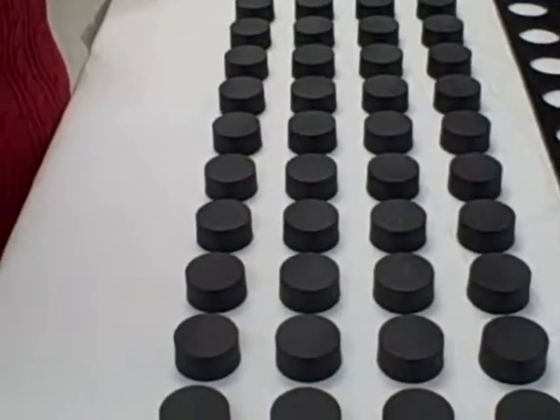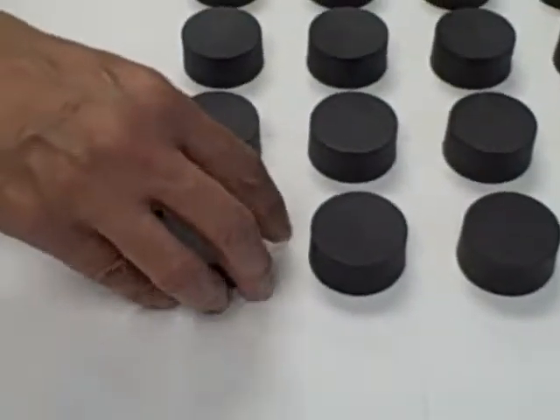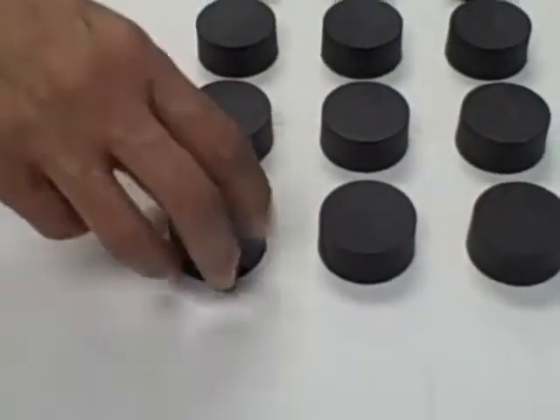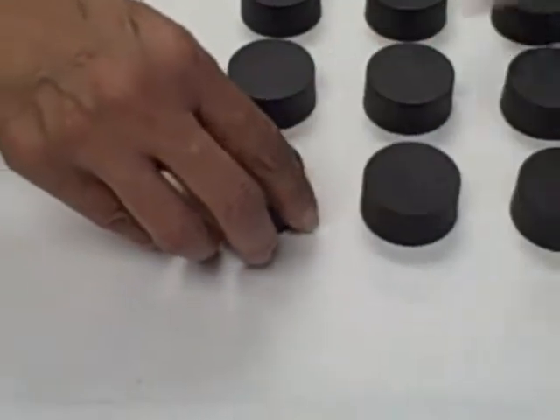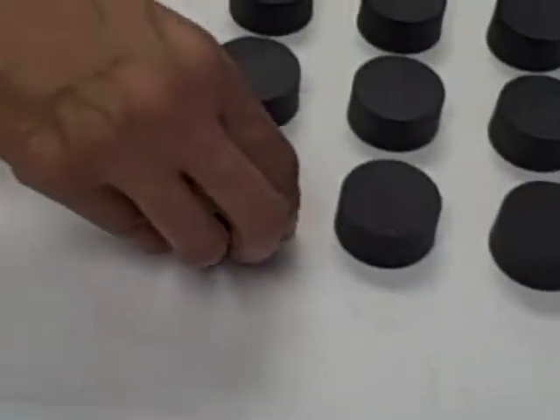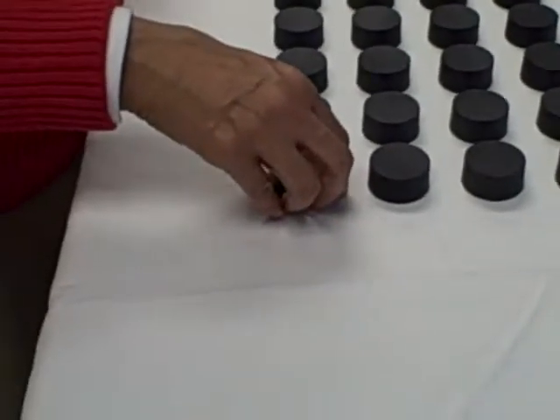So begin on your right, put the bottom block in the top hole, and the next block in the next hole. So you will start with this block into this hole and work your way across. And then you will time the client, so go ahead and start that.